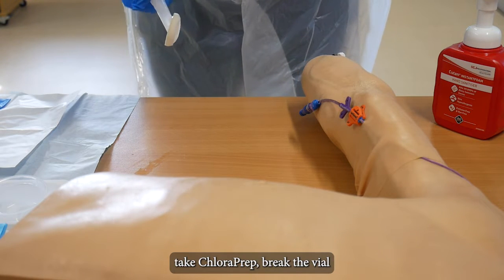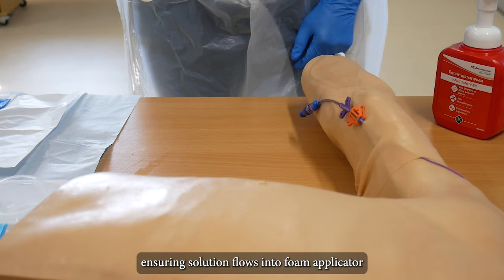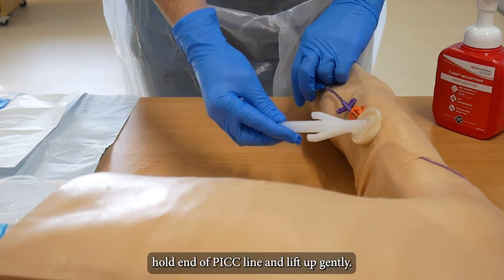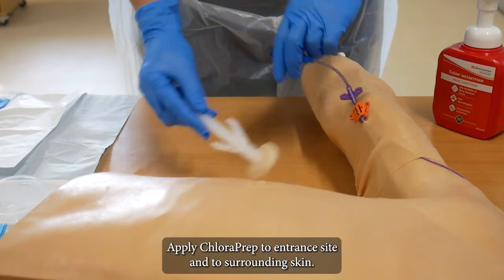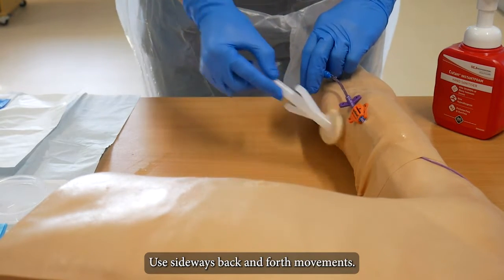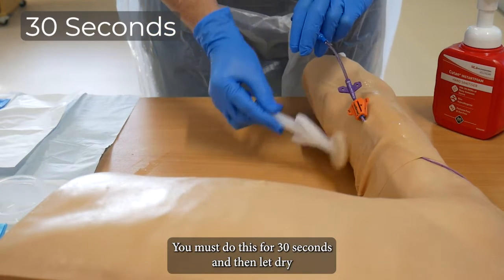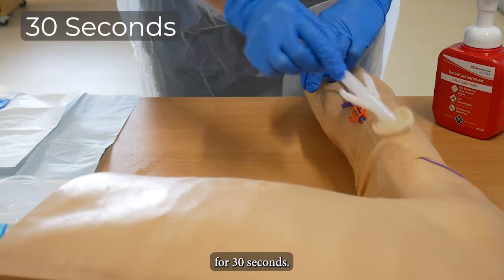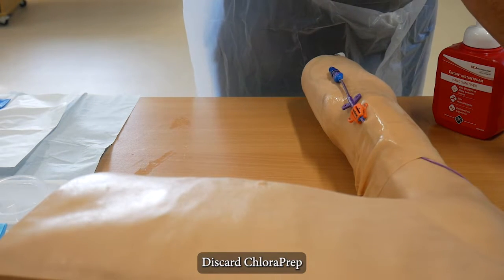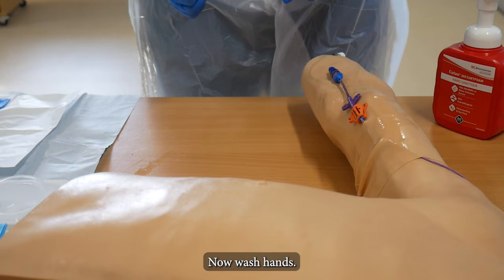Take ChloraPrep and break the vial by squeezing the wings together. Hold downwards ensuring solution flows into the foam applicator. Hold end of PICC line and lift up gently. Apply ChloraPrep to entrance site and to surrounding skin using sideways back-and-forth movements. You must do this for 30 seconds and then let dry for 30 seconds. Discard ChloraPrep — ensure after procedure it goes into the sharps box. Now wash hands.